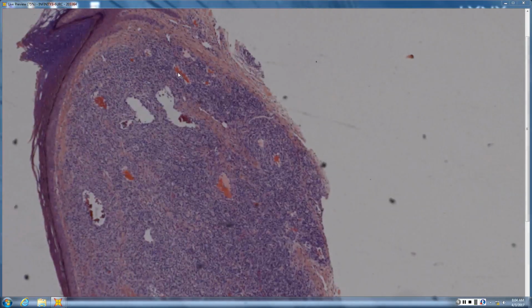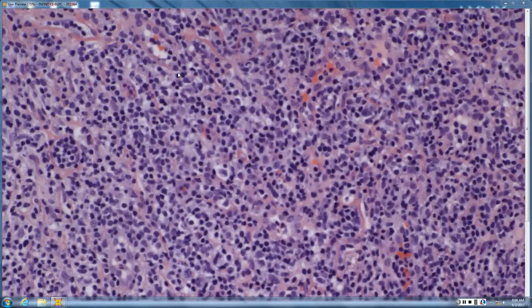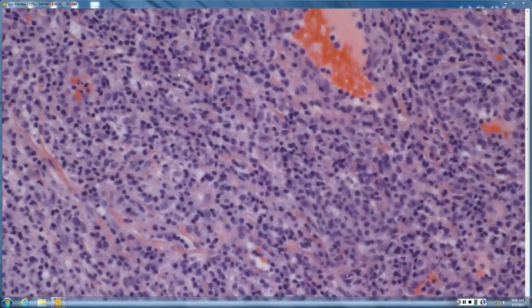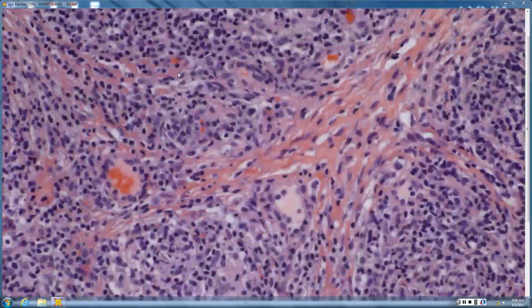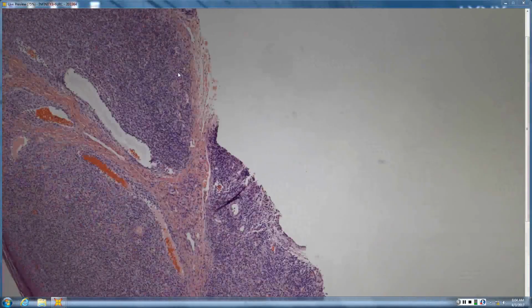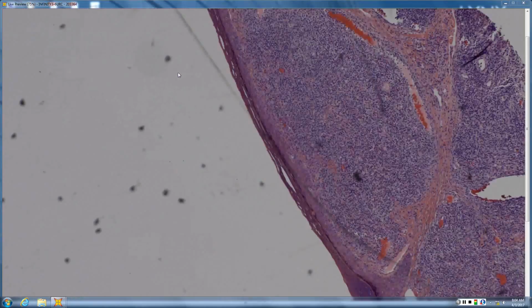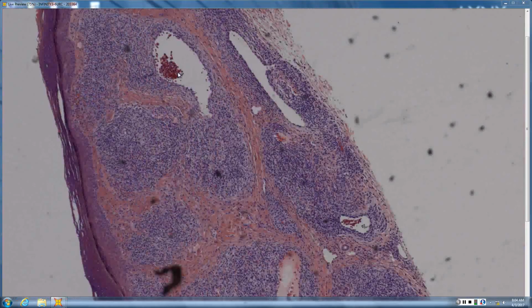It's kind of got a glomus look right off the bat. So you see blue cells, are they lining up like strings of pearls? Not so much. So what if they're actually lymphs? Could think about ALHE, but it doesn't seem to be aggregates as much. With ALHE, you'd expect to find a thick-walled feeder vessel somewhere on step section, and then it can be lobular like a pyogenic granuloma, with lymphocytes and some eosinophils in there, and this actually was an ALHE.